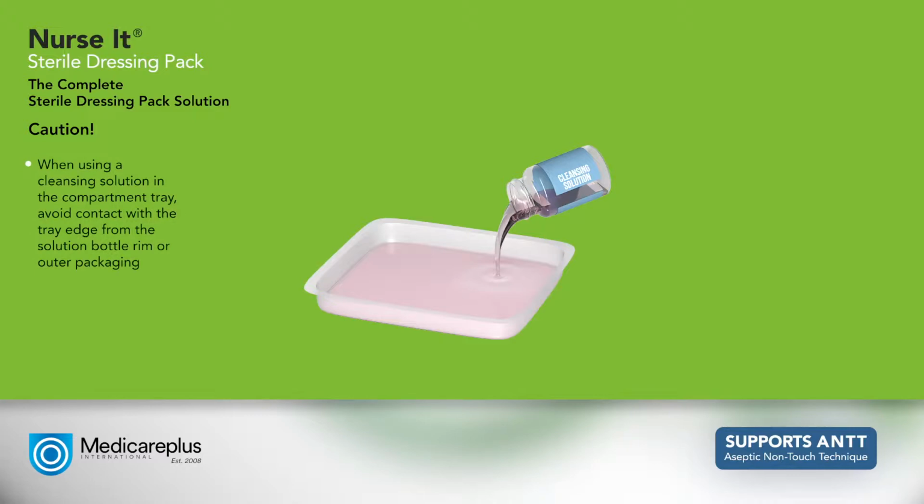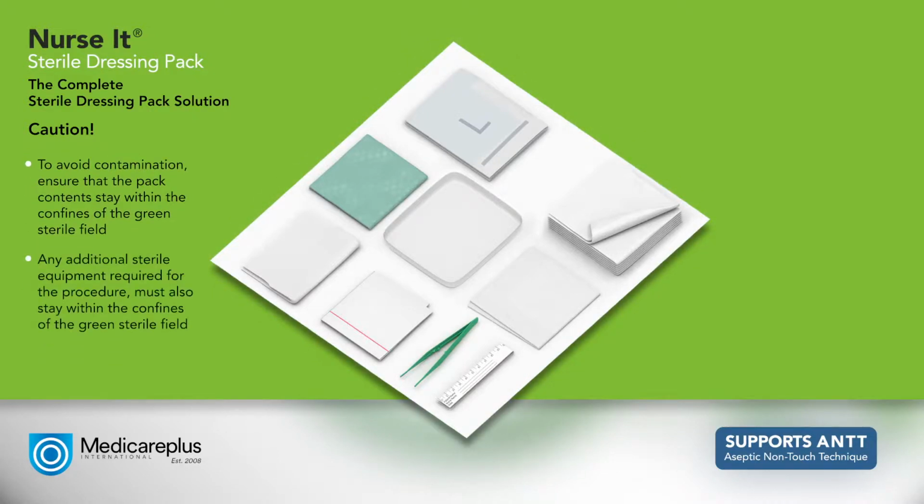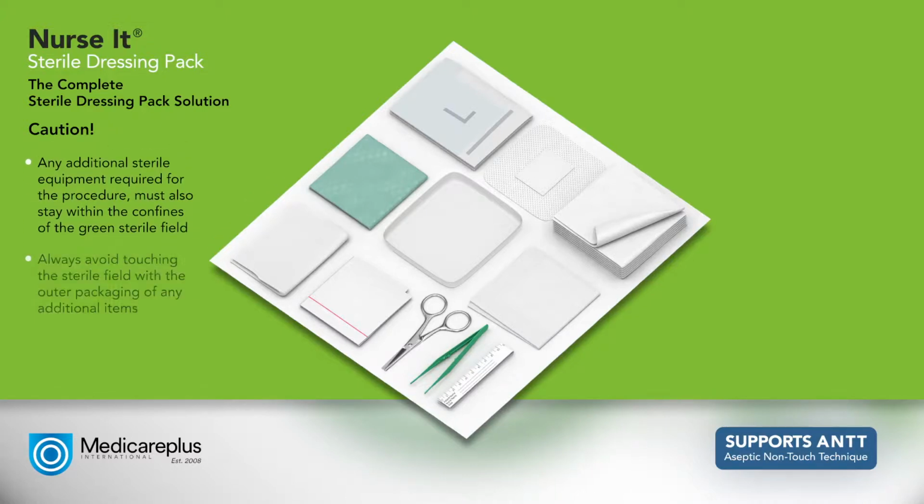Caution: when using cleansing solution in the compartment tray, avoid contact with the tray edge from the solution bottle rim or outer packaging, and take care not to overfill the tray. And to avoid contamination during the procedure, always ensure that the pack contents stay within the confines of the green sterile field. Any additional sterile equipment required for the procedure, for example scissors, wound dressings and devices, must also stay within the confines of the green sterile field as shown. Always avoid touching the green sterile field with the outer packaging of any additional items.